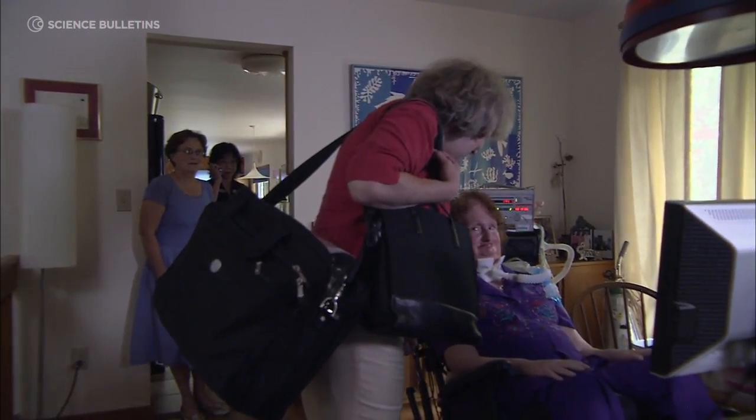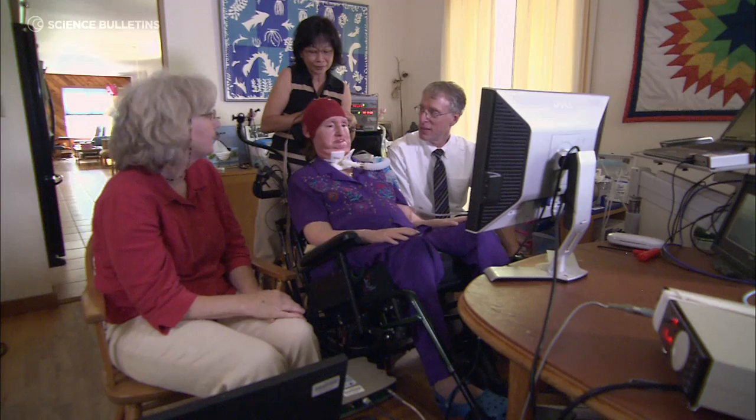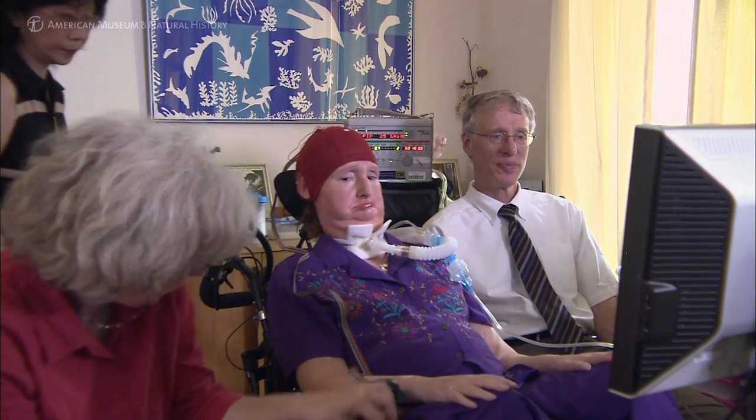Kathy Wolfe is a patient with ALS, or Lou Gehrig's disease, and she's one of the people participating in our group's effort to develop brain-computer interface systems for people who are very disabled. People who are very disabled — not just those who have lost use of their arms or legs, but also those who may not be able to speak, breathe, or even move their eyes. They can live for long periods, but they can lose their ability to communicate effectively with others, and this is a tremendous loss.